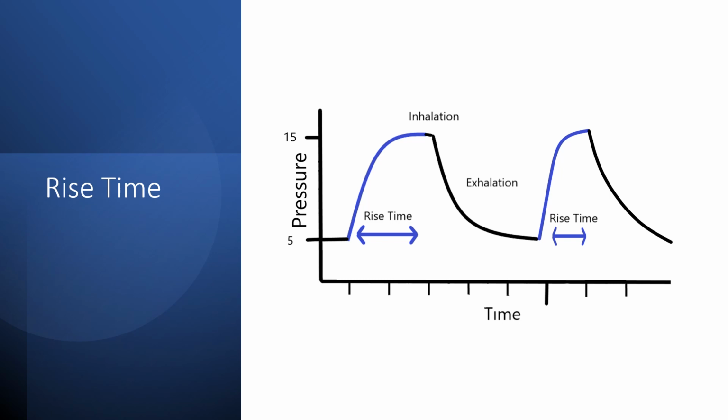And unfortunately, especially in the pre-hospital environment where a lot of providers are using vents like Ravel or Z-vent, those rise times can be longer than what you would want in a bronchospastic patient. For the Z-vent especially, the default, I believe, is 600 milliseconds or 0.6. And so that is about 6 times longer than what you would want in a patient who has severe bronchospastic disease. We typically want it to be about 100 milliseconds or 0.1 seconds.